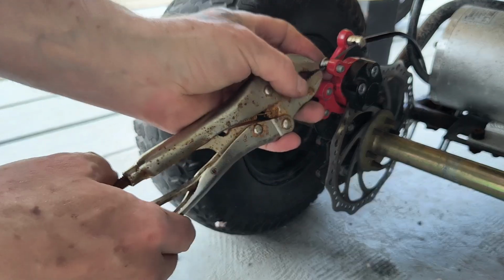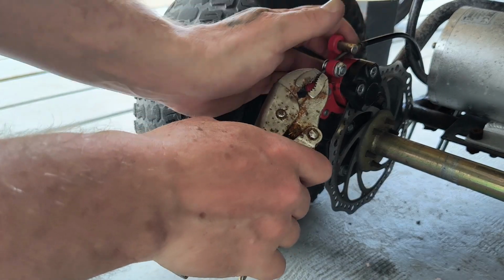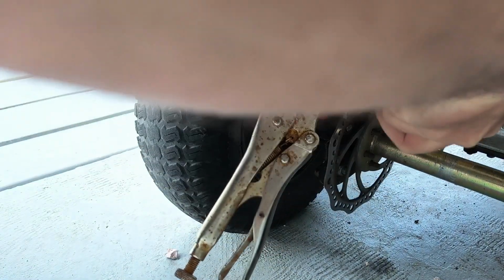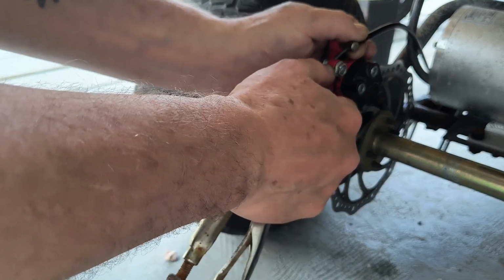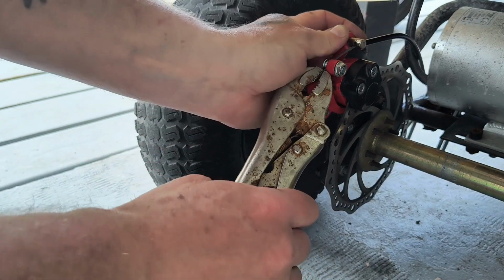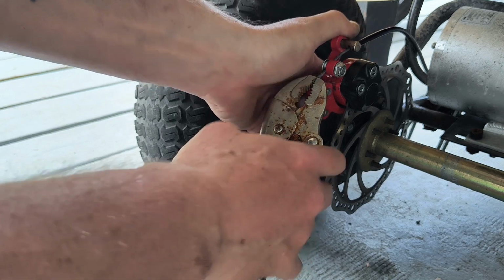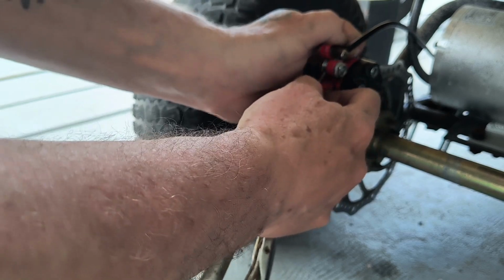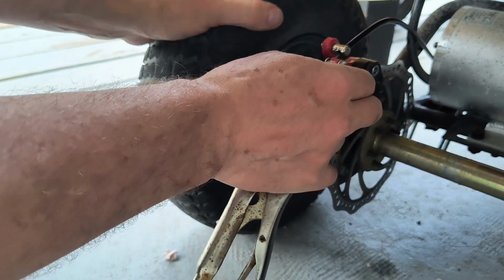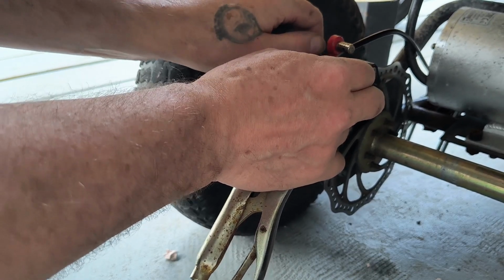Well, unfortunately, in adding this screw instead of the previous one to this setup, we've added another tool to the roster. What we need to work on this thing. That being a 10mm socket. That's locked up good. At what point are they able to move? That's where they can move. That's where they can't move.